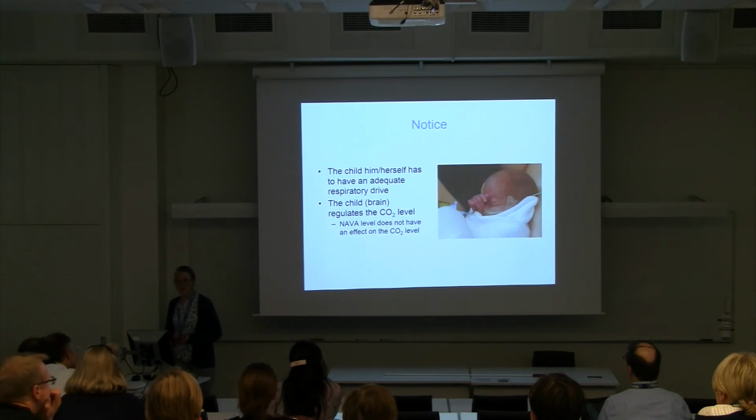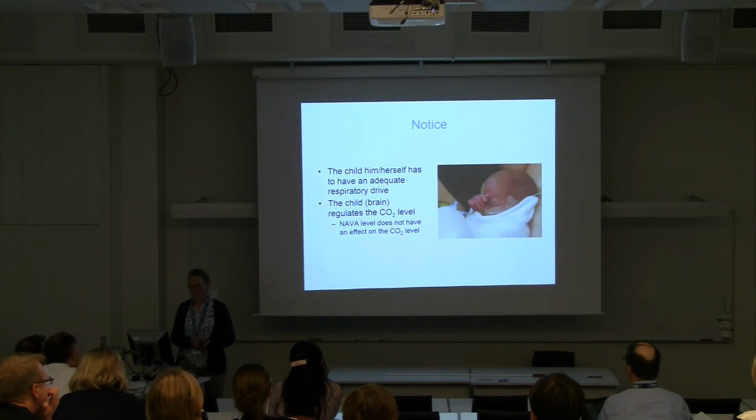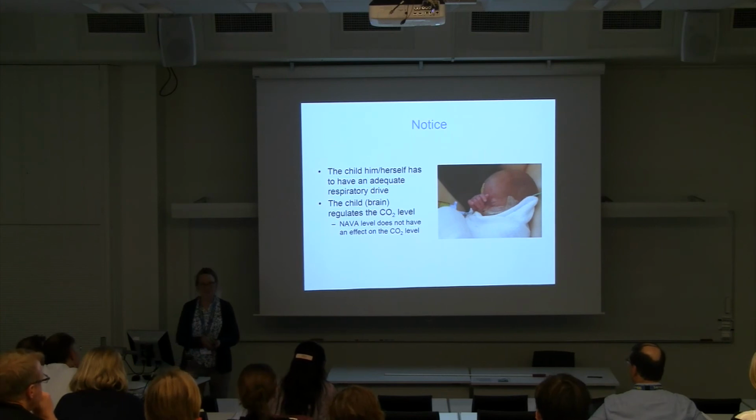In NAVA, one has to notice that in order to make it on NAVA settings, the child has to have enough respiratory drive. And it is the child that regulates the CO2 level. The NAVA level increase does not have an effect on CO2.